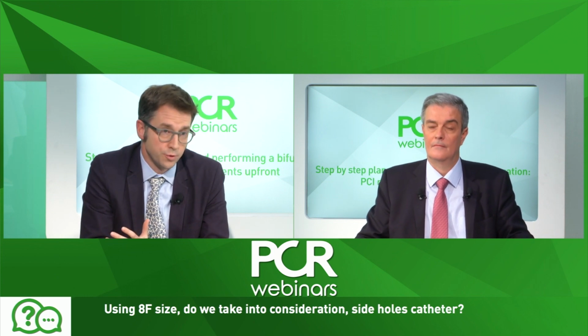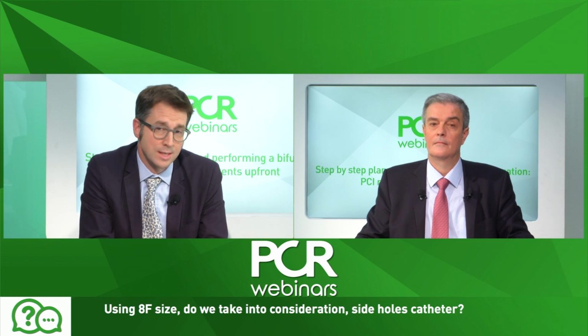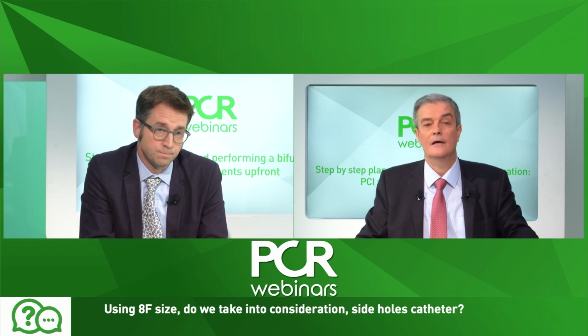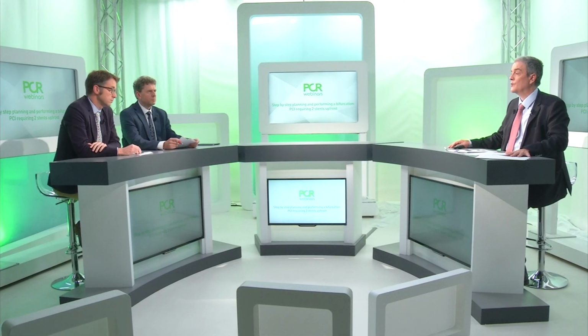So you're not often sure about the nature of the patient's pressure and hemodynamic status. Okay, so no side holes, greater contrast volume. Yeah, no side holes. Protrusion of the side branch into the main branch. What protrusion is considered appropriate? How much you protrude? I think the less the better, yeah.